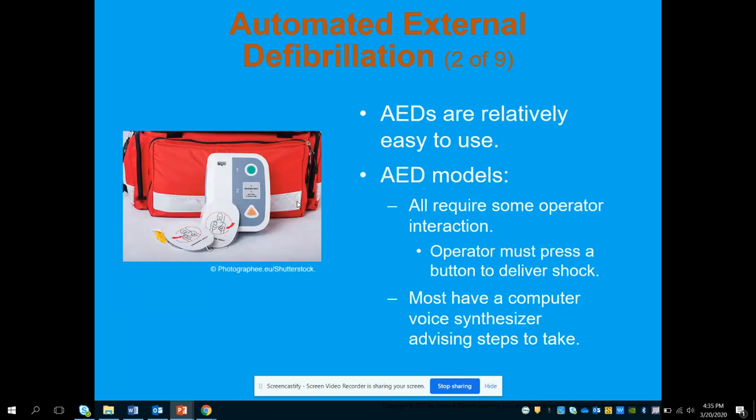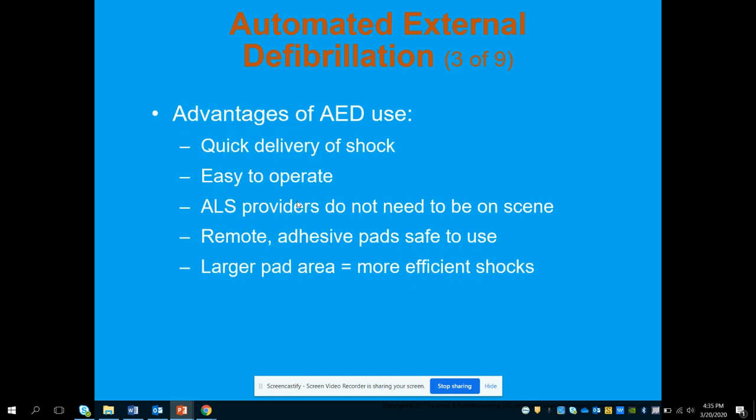So it's going to tell you whether it's shockable or not shockable. We're going to follow the prompts, and make sure that we have the pads appropriately sized and appropriately placed on the patient. We should understand at this point how to utilize the AED after you went through your CPR training. Remember, you don't need ALS providers here. This is an EMT skill to be able to utilize an AED.